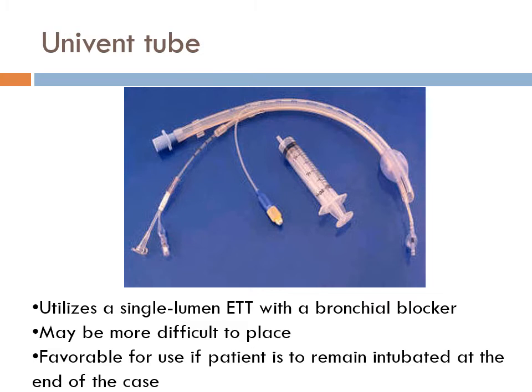The other thing is, hey, look, this big tube is definitely going to cause a lot of laryngeal edema, trauma, a lot of risk. And if you have to go to the ICU afterwards, and let's say you're not taking out an entire lung, or even if you are, and they remain not candidates to extubate, do you really think that patient's going to wake up once he's weaned off sedation in the ICU with this thing in? Or do you think it would have been nicer to have a single lumen tube in? So, what's more stimulating your airway?